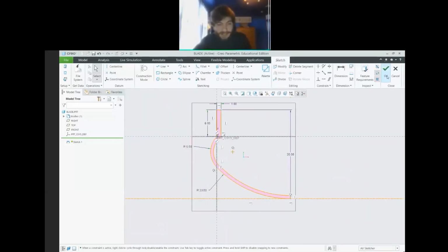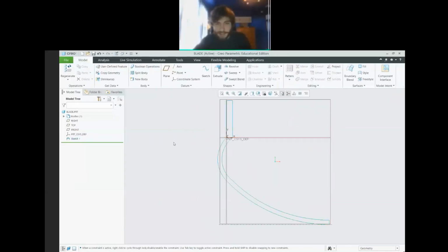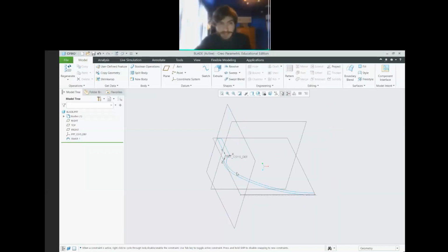We'll go ahead and we'll press the big green check mark, which says we are done with this sketch. And then we will press Control D once we're here, and this gets us back to our default view, right? Our 3D view of it, essentially. And so over on the left, we're going to pre-select our sketch, right? We'll click it.